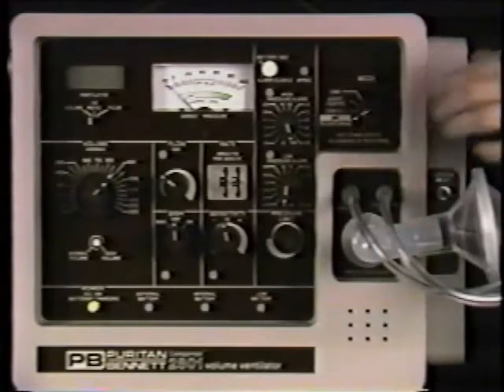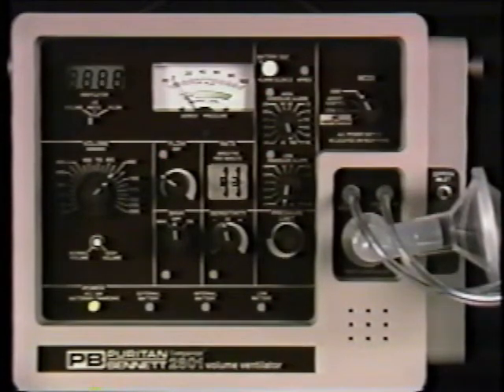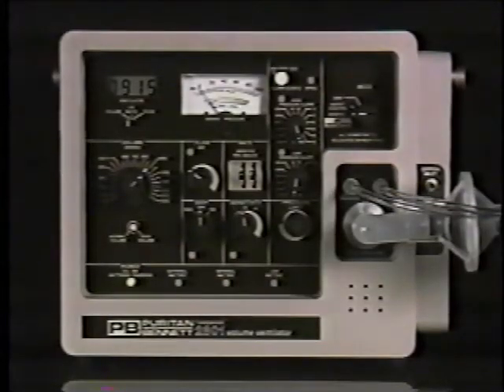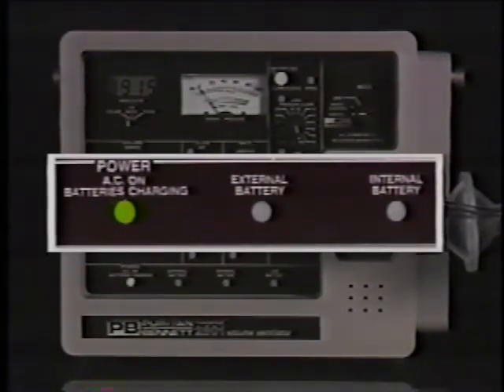Each time the ventilator is turned on or the mode switch is set, the Companion 2801 completes a power-on self-test. During this test, the first ventilator breath is vented out the exhalation valve. This venting of the first breath is called initialization, which establishes the volume setting. The power source that is being used to operate the Companion 2801 is identified by one of 3 indicator lights: AC on, external battery, and internal battery.